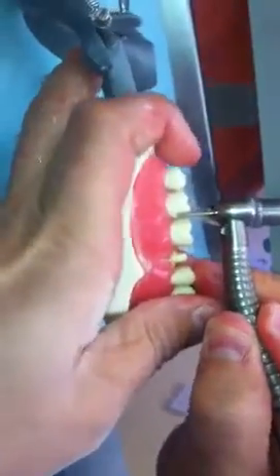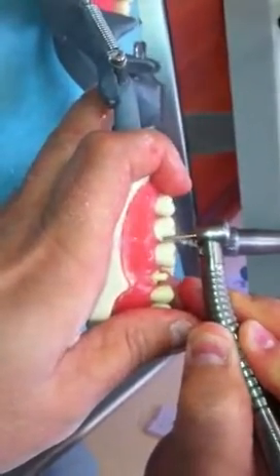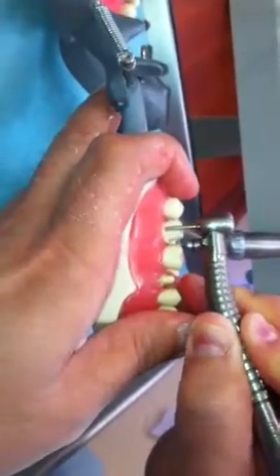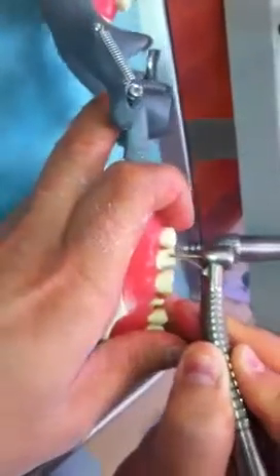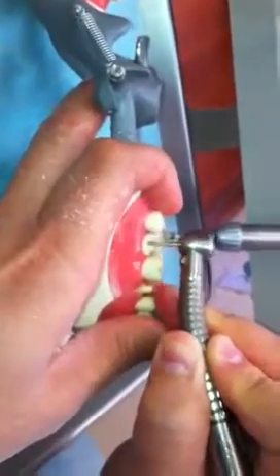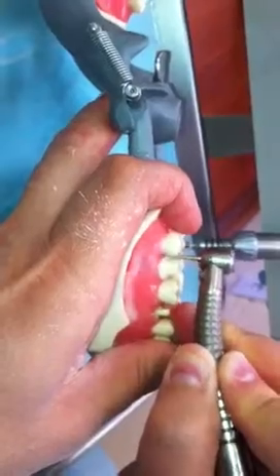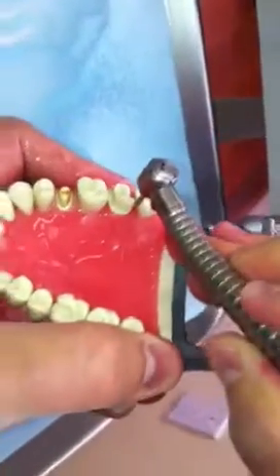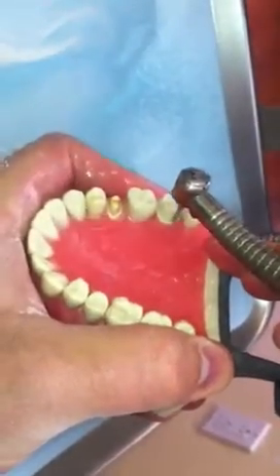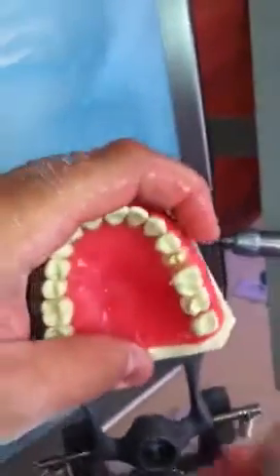There we go. These burrs can cut just like that on a human tooth. You need a little patience and lots of water so you're keeping it fresh. Interproximal — careful. Fix that back part. So we have our shoulders all around.